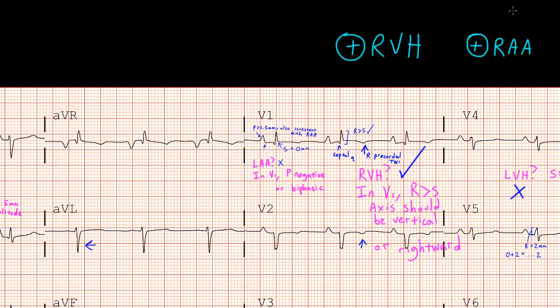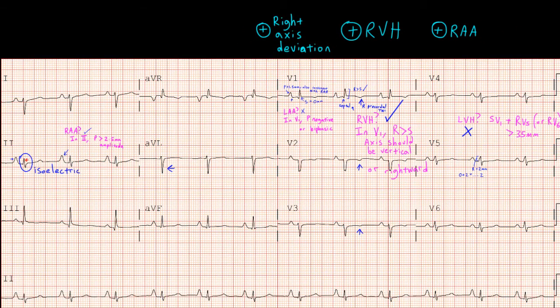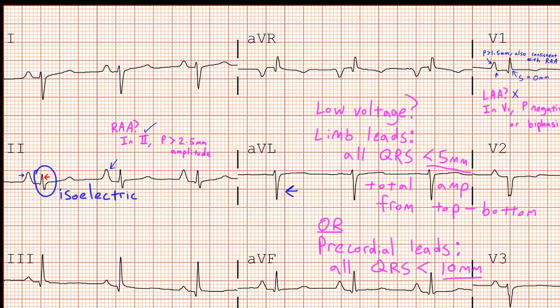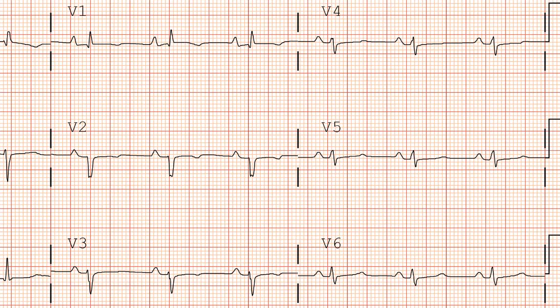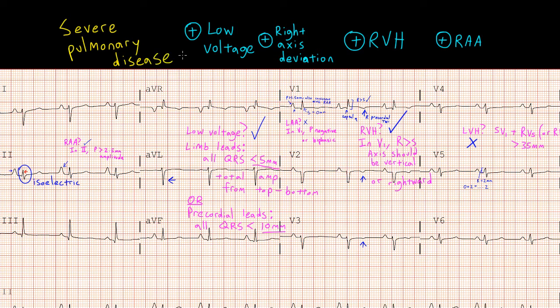So far we've got RVH and right atrial abnormality. Now let's look for signs of low voltage. Eyeballing these QRS complexes, they generally look pretty small. For low voltage, we look to see if the QRS complexes are less than 5 mm from top to bottom in the limb leads, or less than 10 mm in the precordial leads. In the limb leads, some QRS complexes are smaller than 5 mm and others are greater, so we don't meet limb lead criteria. But looking at the precordial leads, all QRS complexes are smaller than 10 millimeters — so we meet low voltage by precordial lead criteria. On this EKG, we've identified right ventricular hypertrophy, right atrial enlargement, low voltage, and right axis deviation — a constellation consistent with severe pulmonary disease such as emphysema. In this case, the patient had severe interstitial lung disease.